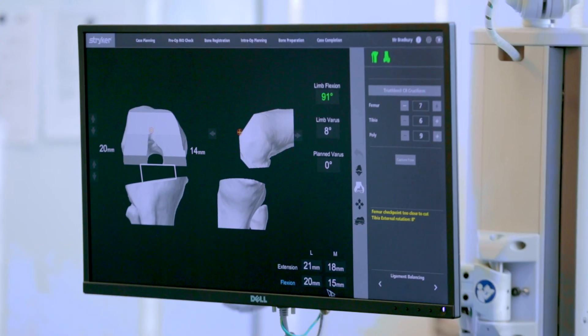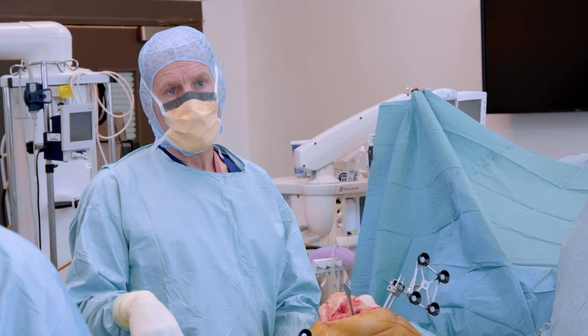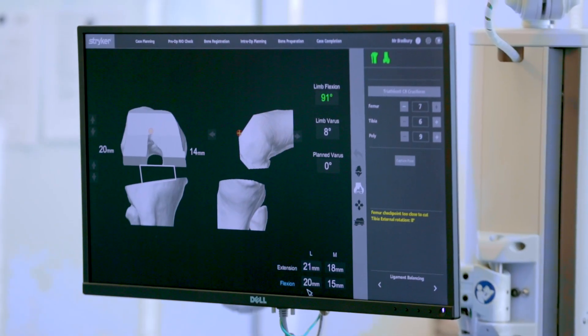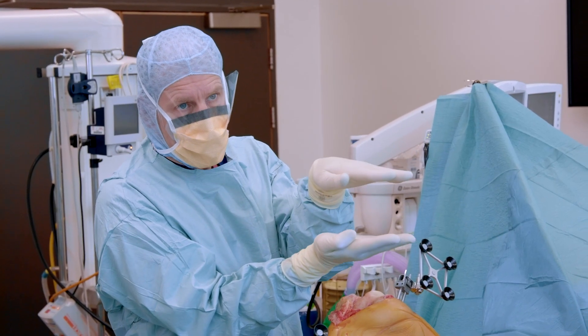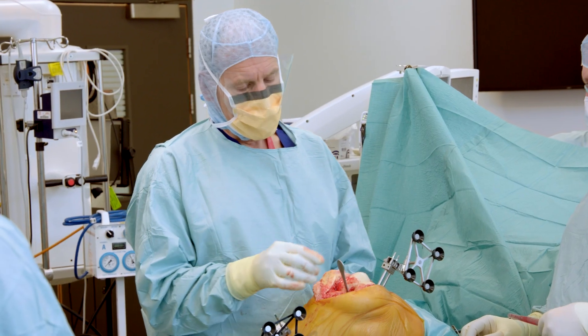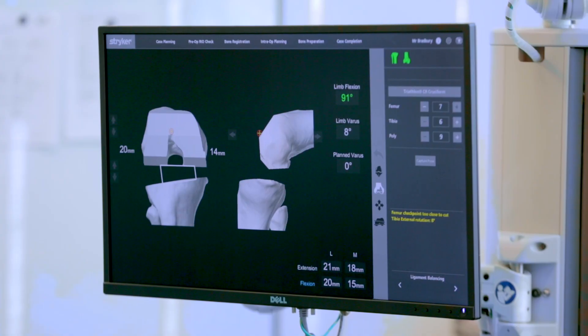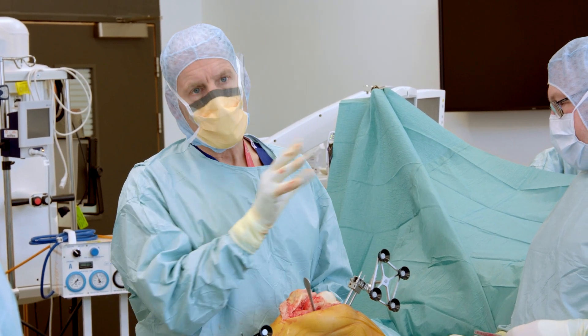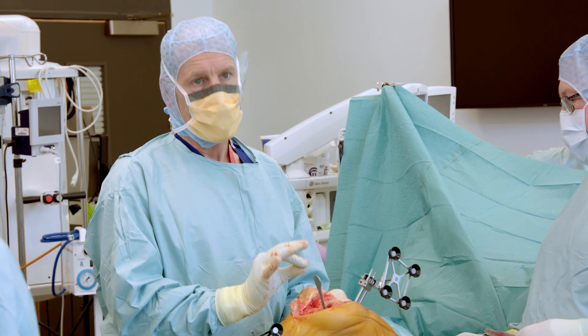If we allow the ligaments to become slack, patients complain of instability; if we tighten it too much, patients will have a stiff and painful knee. Keeping the ligaments precisely the right length is very important. The robot helps us implant the knee such that that tension remains the same, and more importantly we don't have to cut or release ligaments to get the knee replacement in. This gentleman has had a bowed knee for so long that the ligaments on the inside are very tight. What we're trying to do is ensure that the gap between the two components is the same all the way across, so we alter the plan slightly to straighten his leg and ensure it's in the correct position.